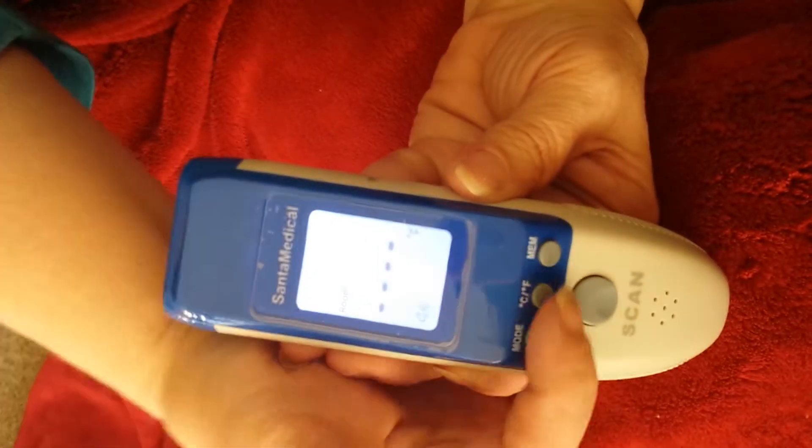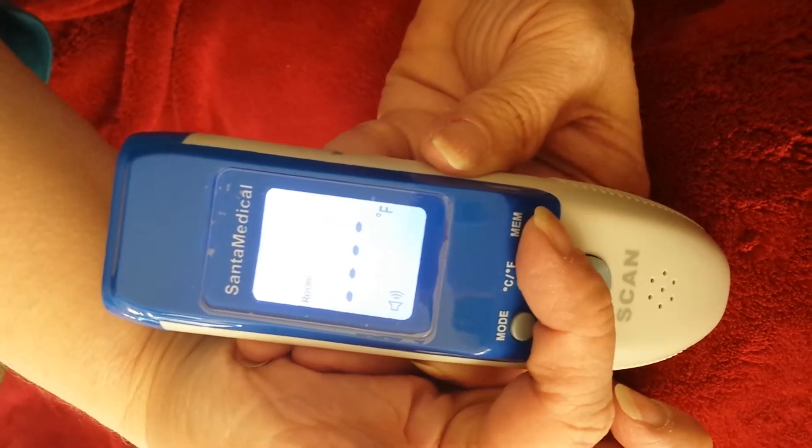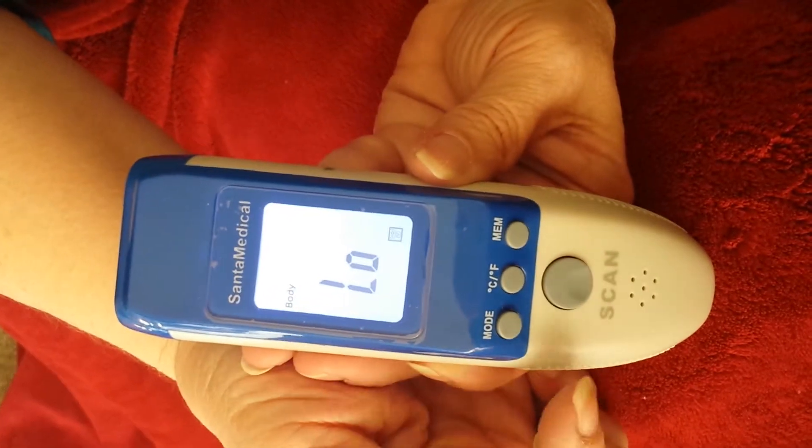You can also switch between Celsius and Fahrenheit. It also has a memory to store what past temperatures have been.